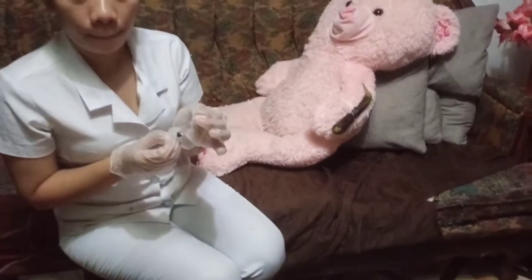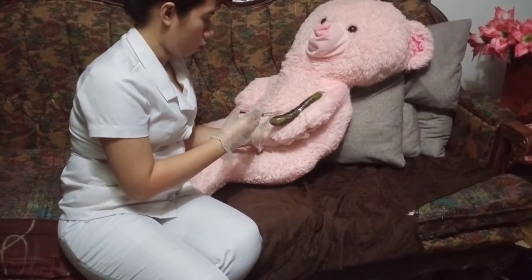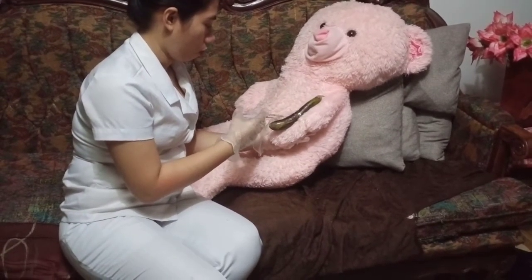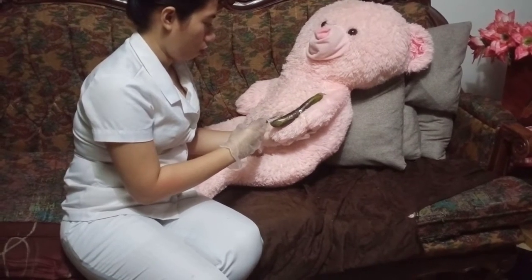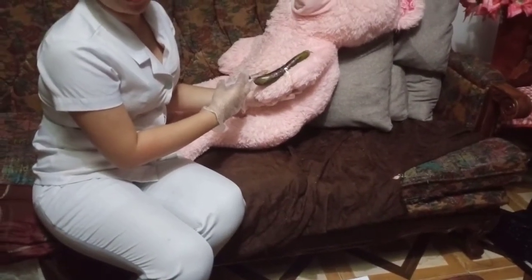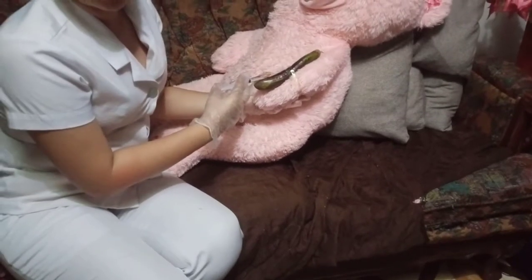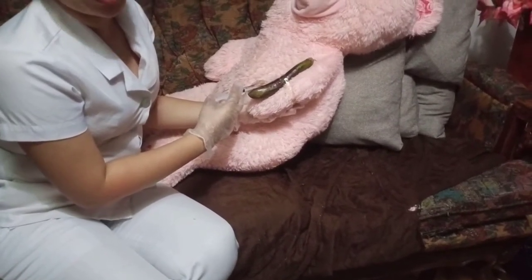Now we're going to stabilize the syringe and needle and inject the medication carefully and slowly so that it produces a small wheal on the skin. Then withdraw the needle quickly at the same angle at which it was inserted. Activate the needle safety device. Apply a bandage if indicated.